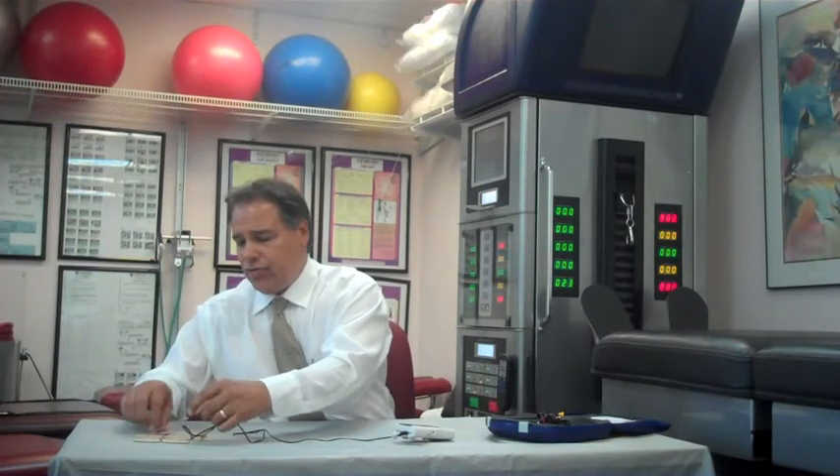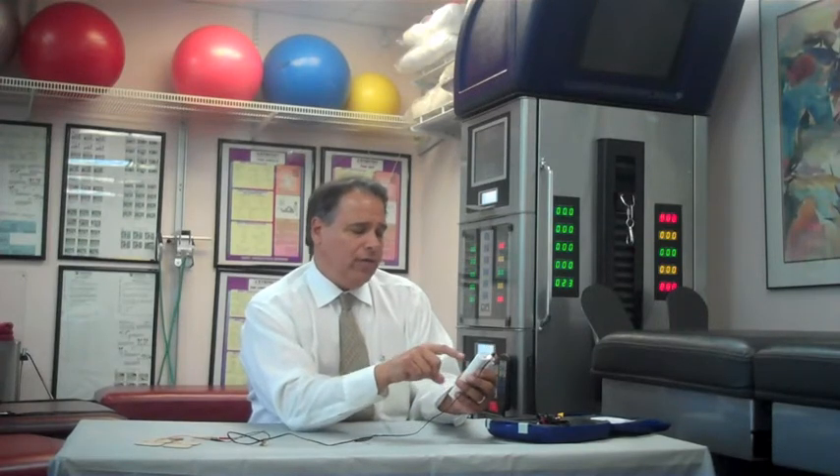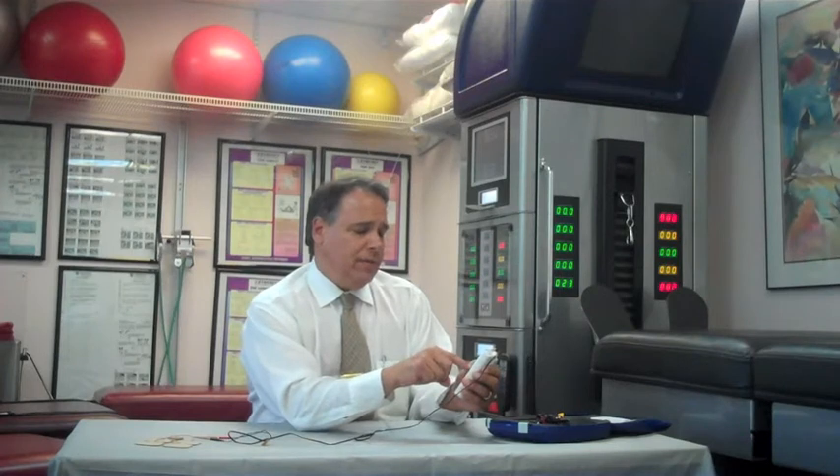Right now we're going to hook up our unit and show you how to go through some different modes. First thing is to connect your lead wire to the top of the unit, and then securely fasten to your electrodes. Place your electrodes in the area of treatment. Turn on the unit by pressing the power button. We're going to set up normal TENS mode, so we'll hit the mode, which will bring us to TENS.